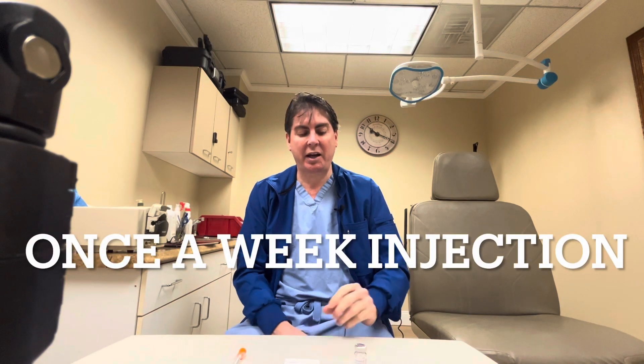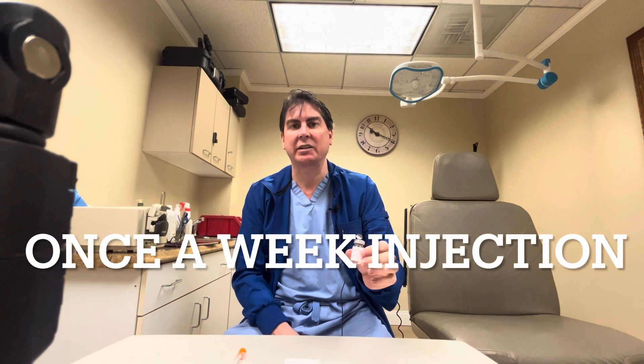Hi, I'm Dr. Varano and I'm going to show you how to inject compounded semaglutide. Semaglutide is the same active ingredient that is used in Ozempic and Wegovy, but for our purposes we have the compounded version.